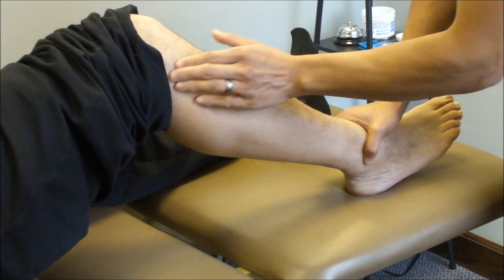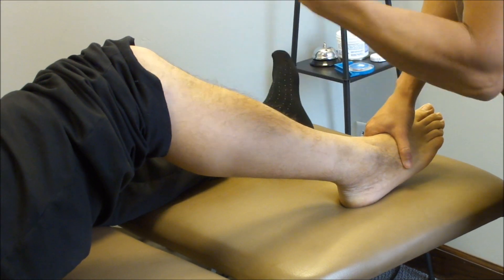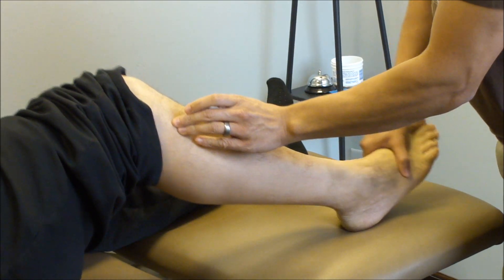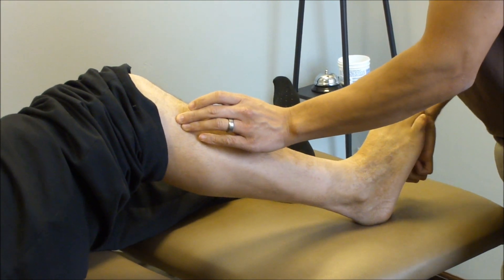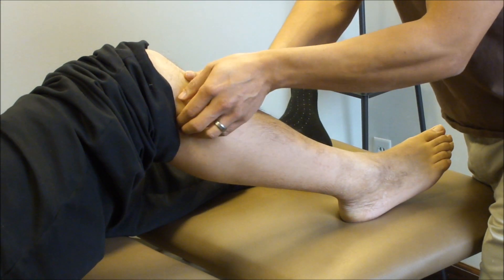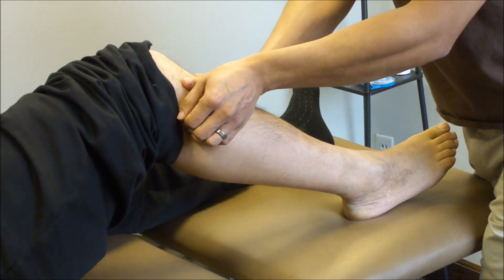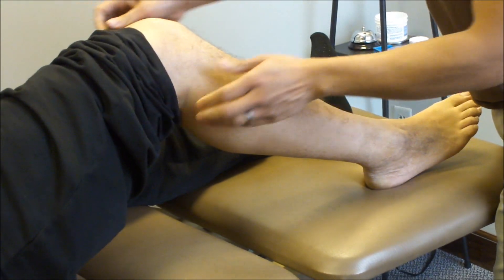As a review, orthokinematically the fibular head needs to glide anterolaterally in either open or closed chain dorsiflexion. I can feel even with slight dorsiflexion that it's slightly gliding anterolaterally. The traditional mobilization is stabilizing the tibia and pulling the fibular head anteriorly, which I do very little of.